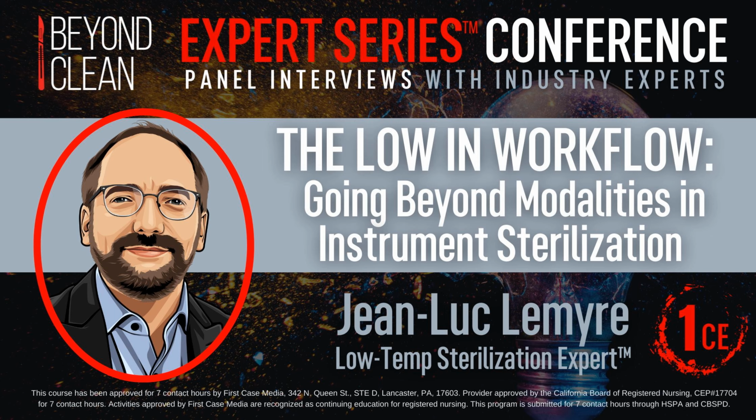As you may know, vapor tends to go everywhere, to occupy all of the volume available. So that's how the peroxide vapor can travel into the lumens, into the crevices. We want it to go everywhere that is accessible to do its job and sterilize. So that's the injection step. Some sterilizers inject a fixed amount, others inject to a fixed pressure, but the goal is to get enough peroxide to sterilize your load.